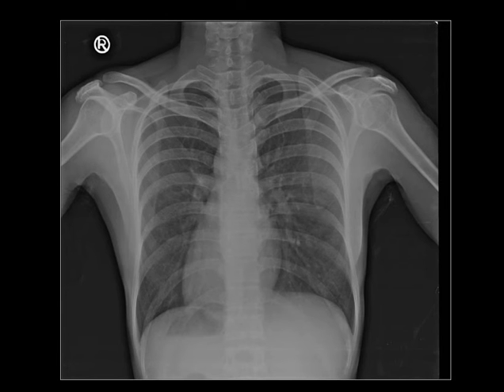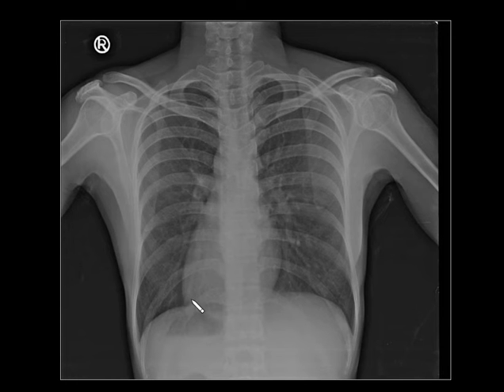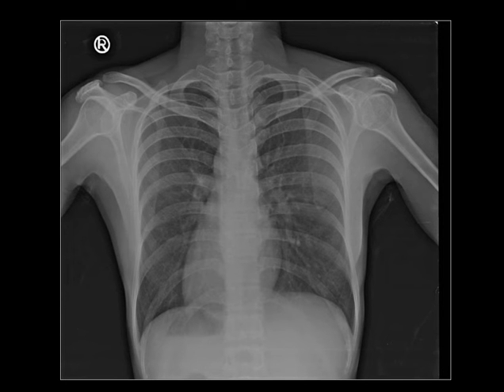Coming to the next case, the left apex of the heart is on the right side and the stomach bubble is on the right side. This is a classical case of situs inversus. If situs inversus is associated with sinusitis and bronchiectasis, remember Kartagener syndrome.